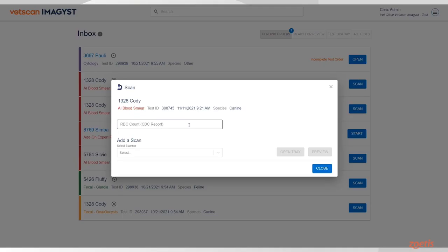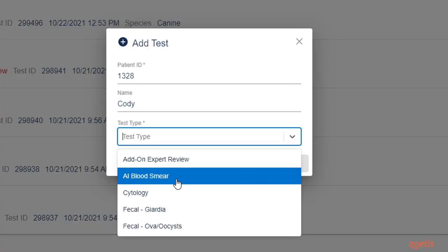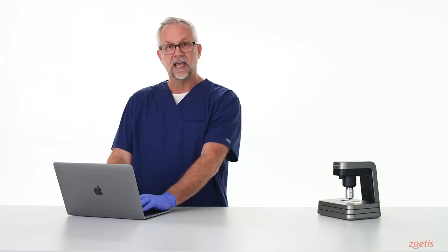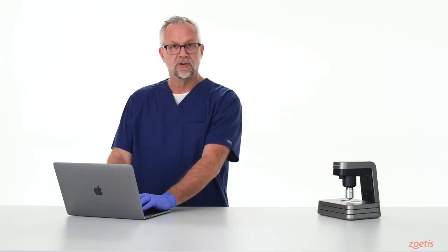With VetScan Imagist, you have access to AI fecal parasite tests, digital cytology, and now AI blood smear, including the possibility to request an add-on expert review.